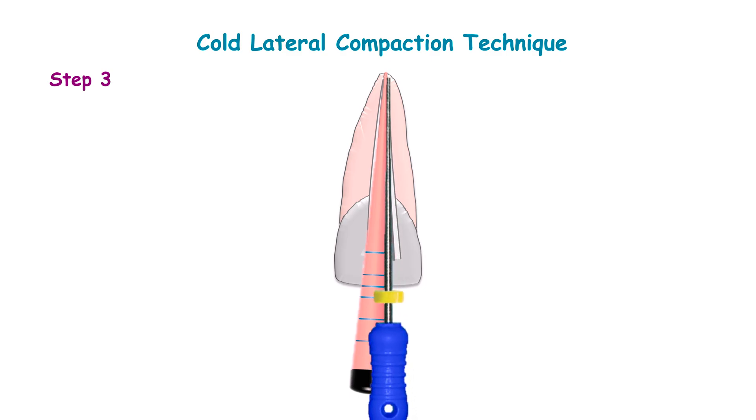Use a spreader for lateral compaction. The size of the spreader is determined by the width of the prepared canal, and it should reach within 1-2 mm of working length. Then apply gentle apical pressure and lateral pressure, pushing the master cone laterally against the canal walls.